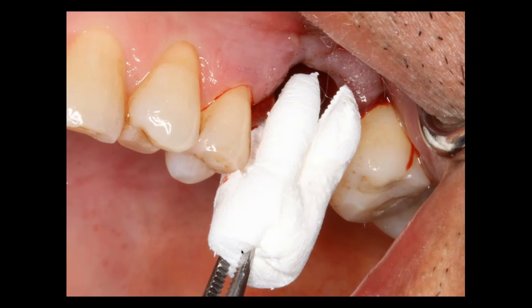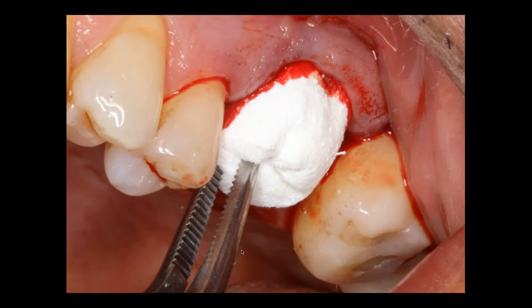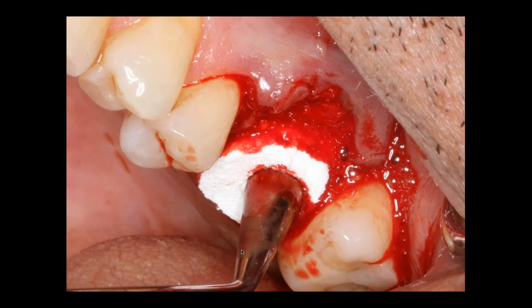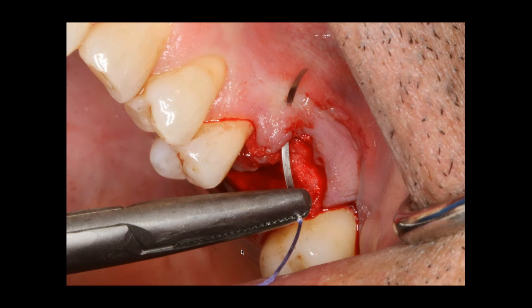Once it's cleaned out, you can see I'm taking my osteogen plug that's been trimmed into three pieces, and I'm slowly just placing it into the socket and it's absorbing the blood. Then I'm going to pack this material firmly — we're not crushing it, it's not amalgam — but I want to pack the material firmly to the crest of the ridge. There's no membrane involved here.